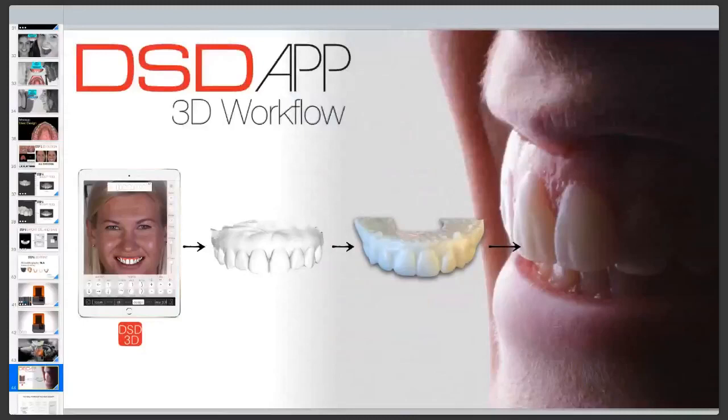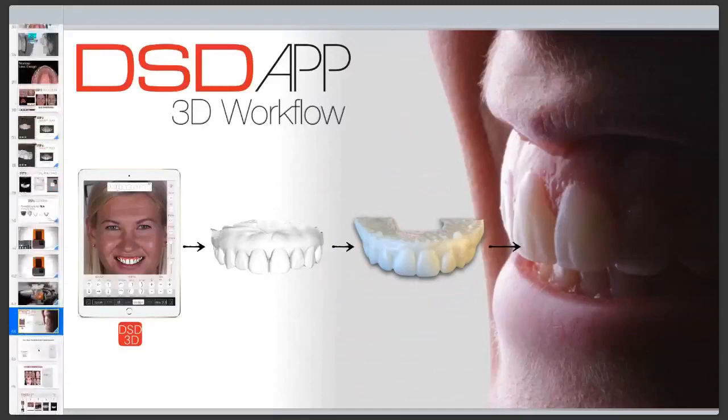And if your patient can come for the first consultation, you can take all records and then tell your patient maybe go for a coffee, or go shopping, or for a walk, or even go back to work, right? Depending on how close the patient is to you. Then you can have your team working on the case, designing in 3D, printing the model, post-processing, creating a silicone guide, and then you can perform a mock-up on the same day. So that's a really powerful thing that the app can provide us, and it differentiates from everything that already exists.